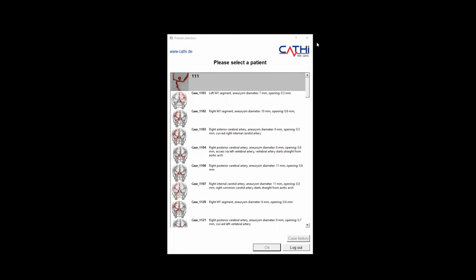Also, I mean building a curriculum. So you can build or assign specific courses or modules for your students. You can give them their username and password. They can run on the device without you, as instructor, being there. So it can be done with the tech in the lab or anyone inside the cath lab room. So this is a very good option. At the end, you can also get an evaluation form that gives you in more detail what is done by the resident or by the student.